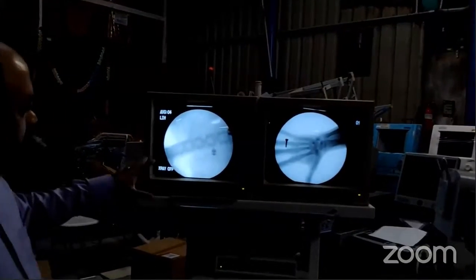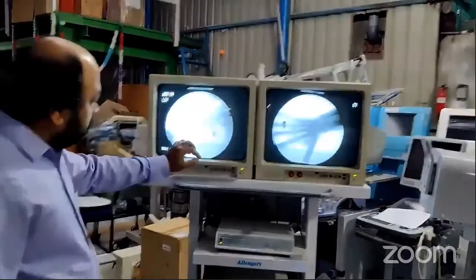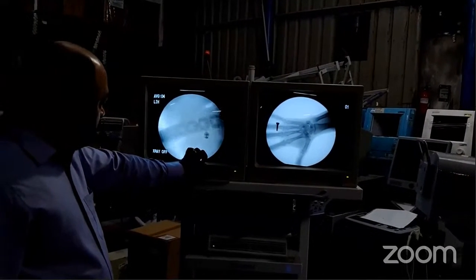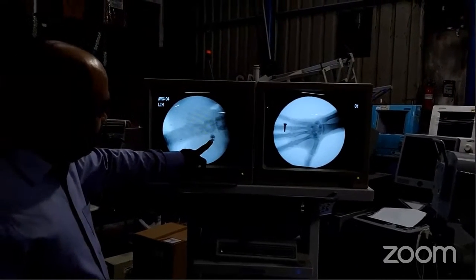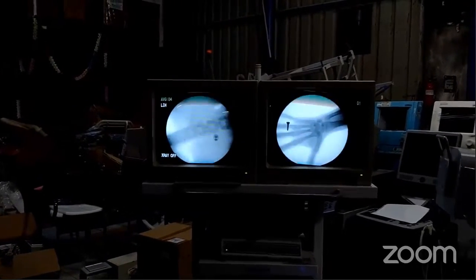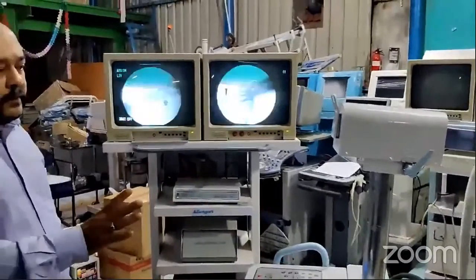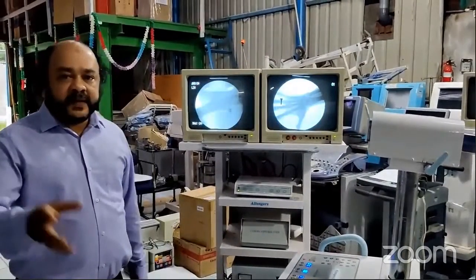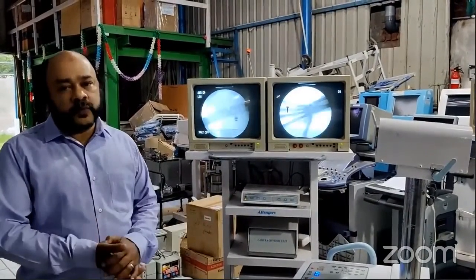Okay. So after the expose, you can adjust the post processing. I just showed you what a C-arm is, how to expose, how to set the kV and mA, and how long I can shoot. Everything I just explained to you. Anyway, what we'll do, we'll open the C-arm and we'll explain some more techniques.